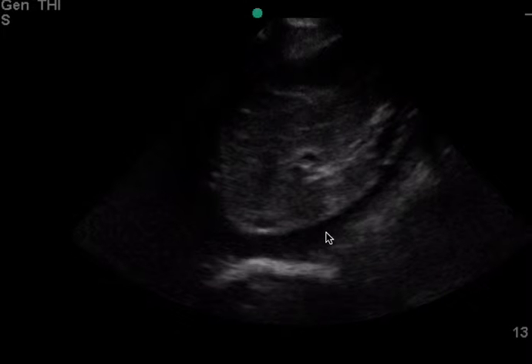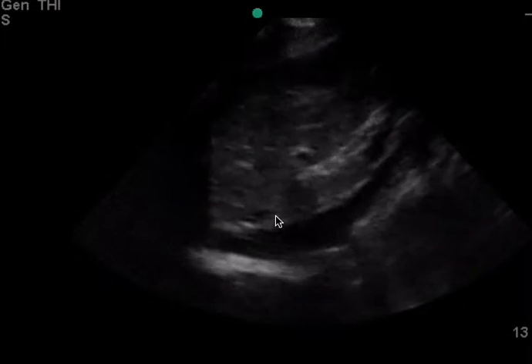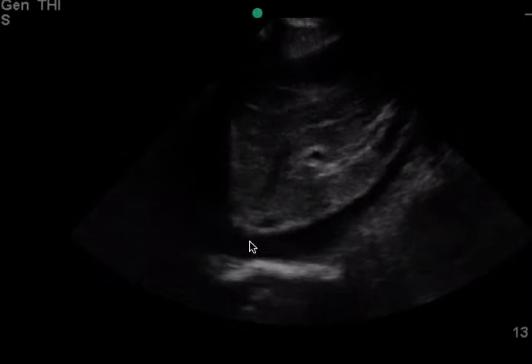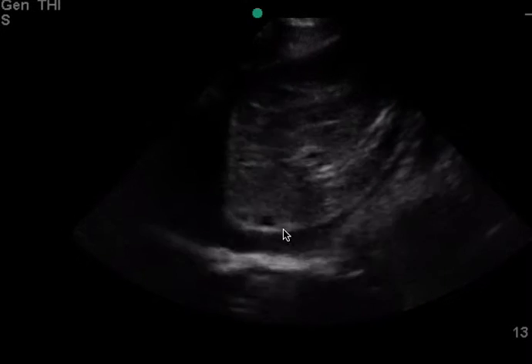This is an IVC ultrasound and also an echo. We'll go over the IVC first. When you look at the images here, you can tell that it is neither fully plump nor fully collapsing. So you can't really use it to make a clinical decision.